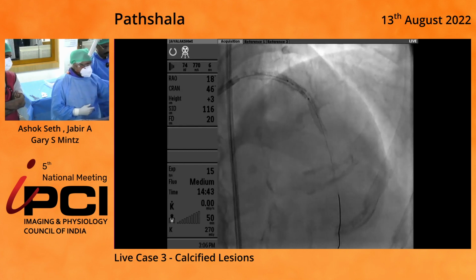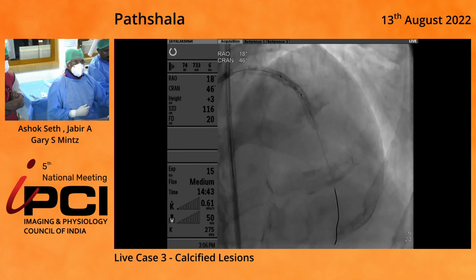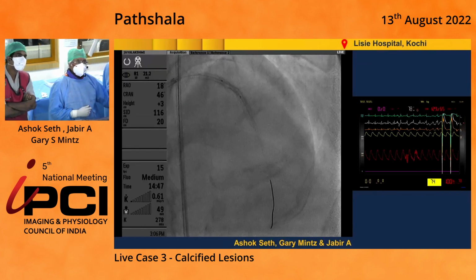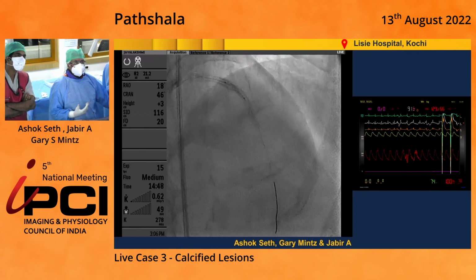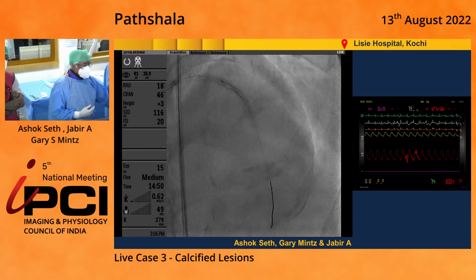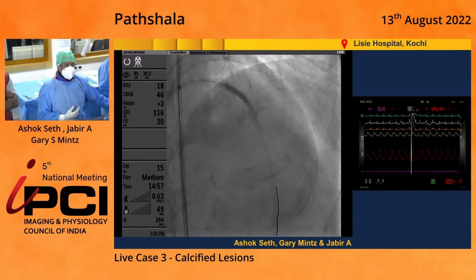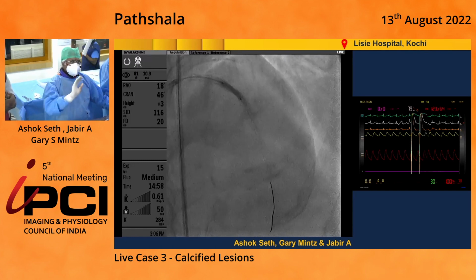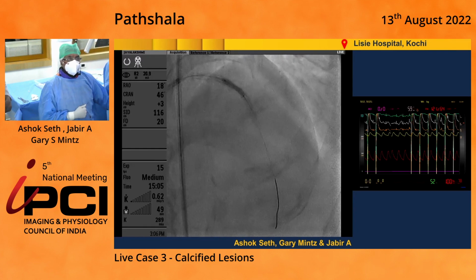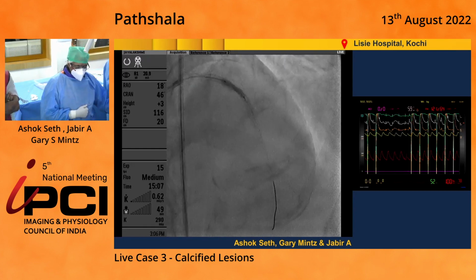So go to 4 atmospheres. Who's handling that? So you're going to 4 atmospheres. You want to be sure that there's. So I'm at 4, sir. Okay, and here the IVL pulse is getting delivered. Now, after this, we are concentrating on this lesion because that's our lesion of action. Shall I go to 6 and come? Right. And deflate.